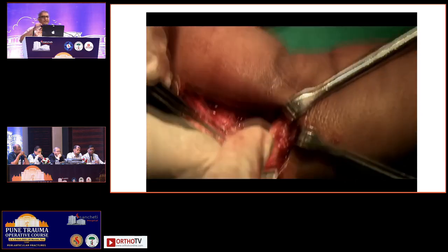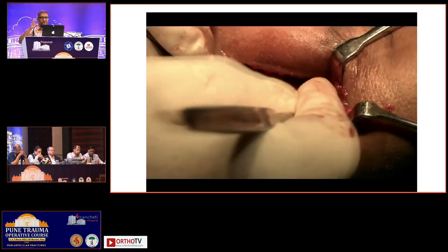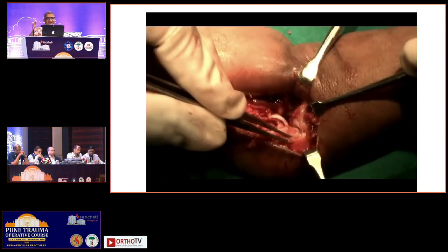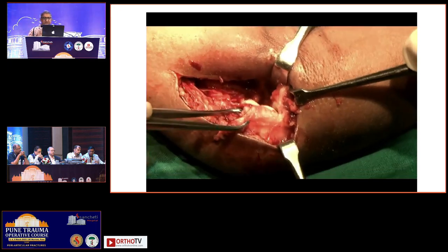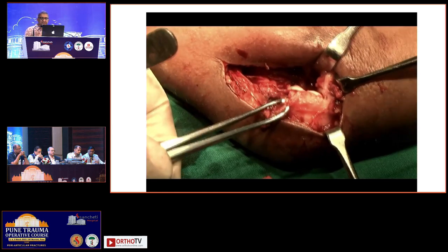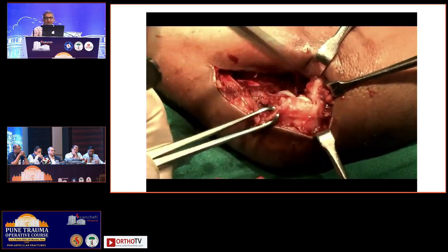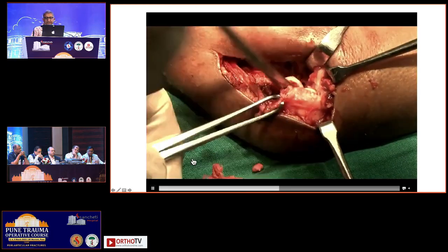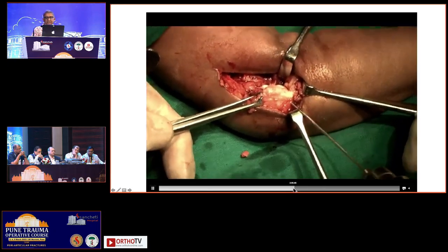I am holding the fracture with a small Edson forceps. No harsh instruments here, no towel clips, no bone holding forceps. Sometimes you can use wires. So I am using Allis forceps here to mobilize this fragment. And then I use a joystick, two K wires, to hold this fragment and rotate it in proper fashion. Okay, so this is one wire.